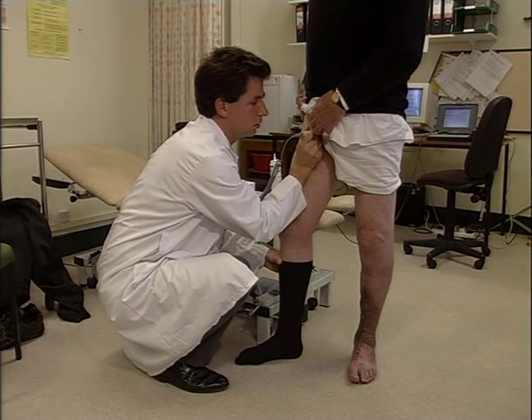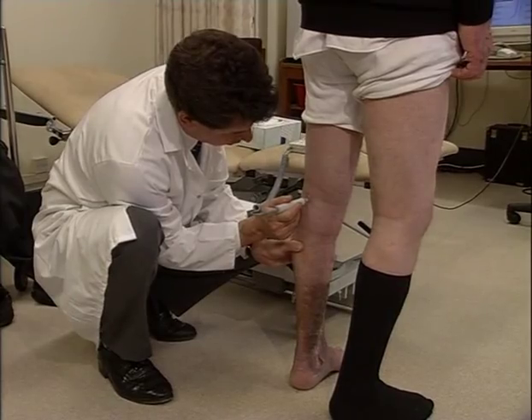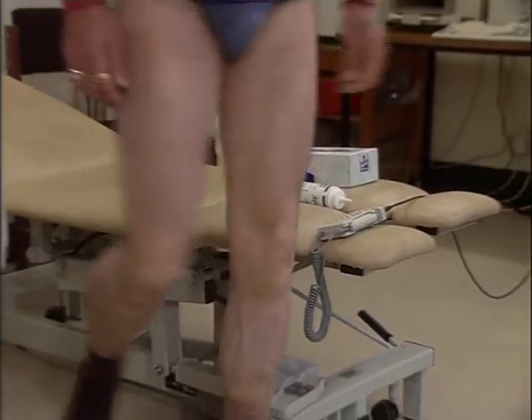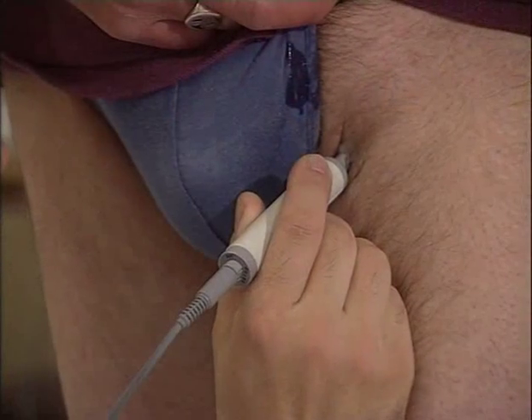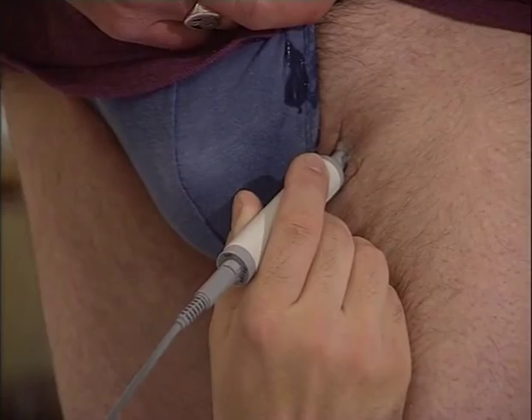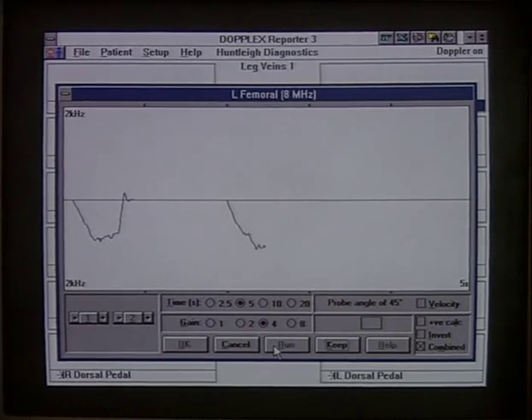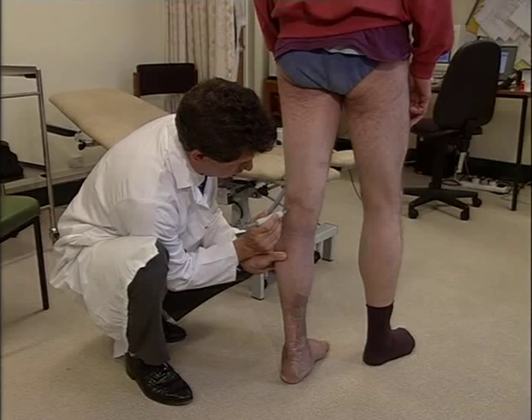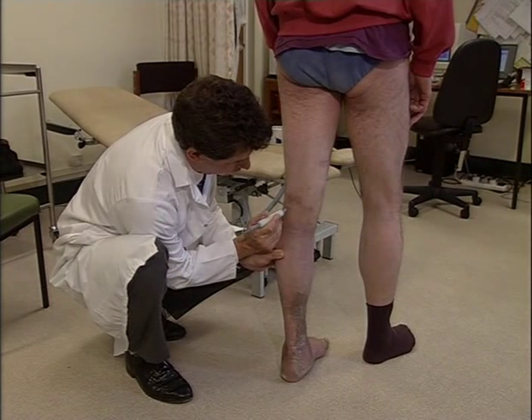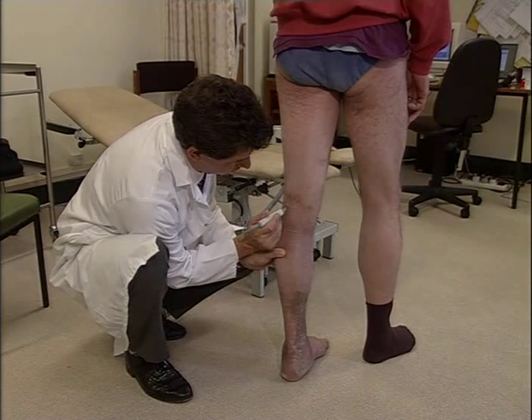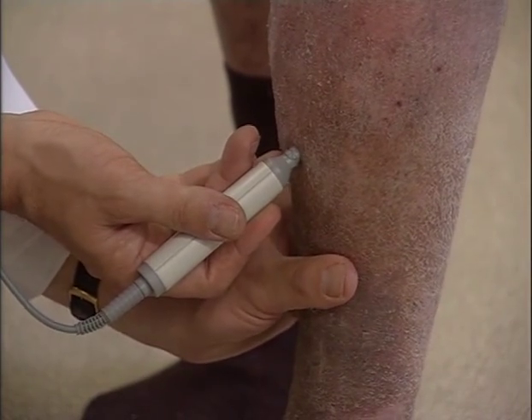The right leg shows some incompetence at the groin, but the popliteal vein in the left leg shows no reflux, nor is there reflux in the right leg. This patient had a deep vein thrombosis 15 years ago and has had multiple recurrent ulcers in his left leg ever since. The examination of the long saphenous vein, again with the probe pointing towards the heart, shows no significant retrograde flow. A small degree of retrograde flow is seen, which coincides with the closure of the valves, and is normal. Moving medially from the popliteal artery, the saphenopopliteal junction is located. There is anti-grade flow but no retrograde flow. Following the vein down the leg, there is no reflux, so the superficial veins appear competent.